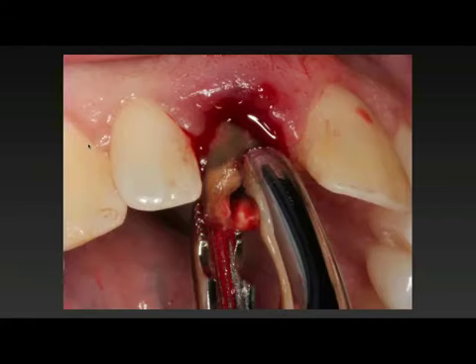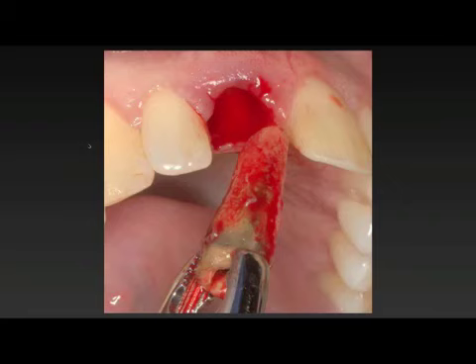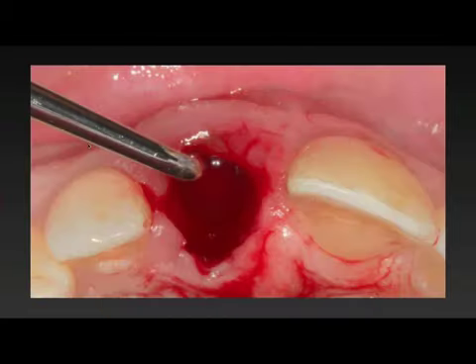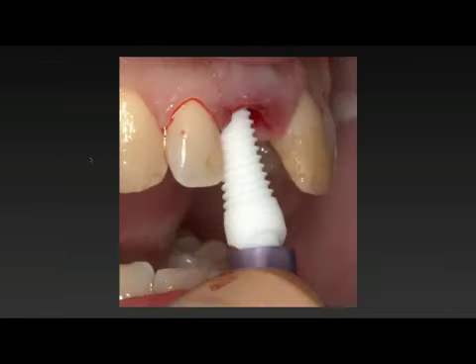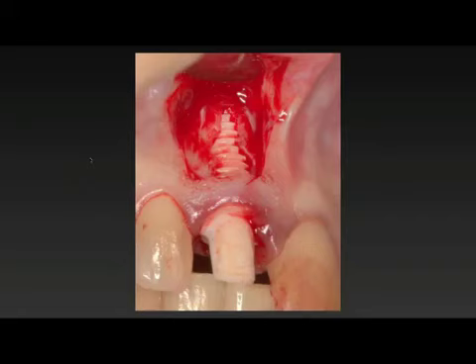And we're going to see the vertical fracture on the facial of that tooth. We're checking the socket, and in this case, we indeed found a small dehiscence on the facial. We prepare our osteotomy and introduce a CeraRoot 11 implant, and we're going to notice that we had a large defect in hindsight. And again, I treat all these cases as learning opportunities.